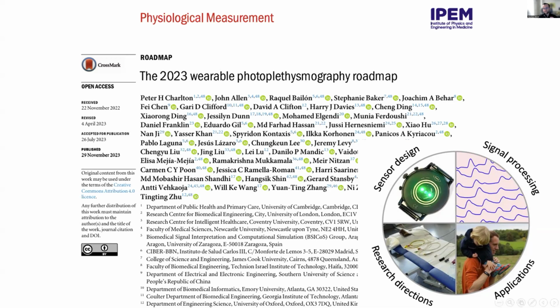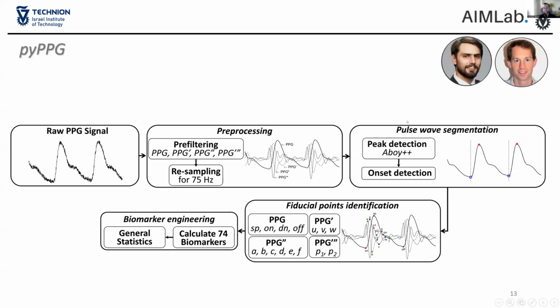If you are interested in learning more about PPG and its application in healthcare, I really redirect you to this rather major piece of work we published a year and a half ago, the 2023 Wearable Photoplethysmography Roadmap. It talks about the technology, the signal processing, and the research direction moving forward. So I really recommend looking at this piece if you are interested in digging in.